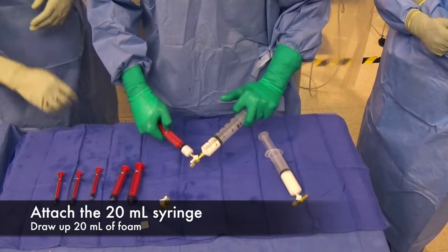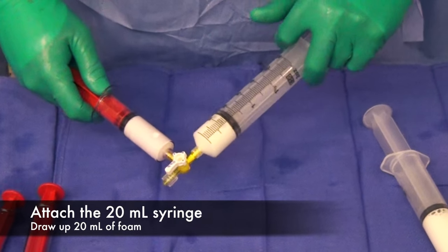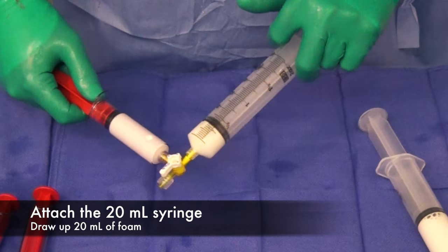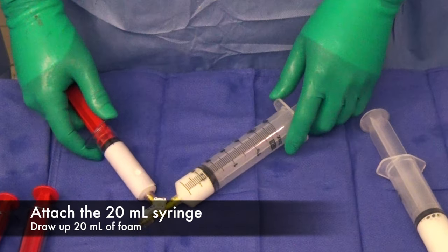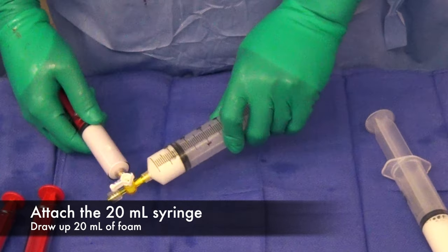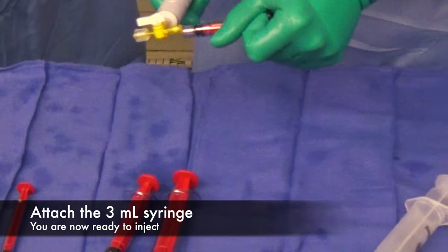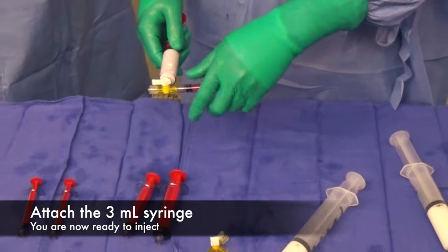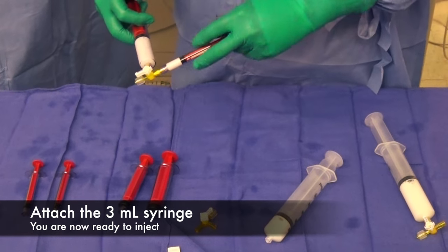Now transfer 20 milliliters of the foam to the polycarbonate syringe. When detaching the syringe, pull back slightly with negative pressure to avoid spillage. Now attach a 3 milliliter polycarbonate syringe to the stopcock and draw up a portion for treatment.